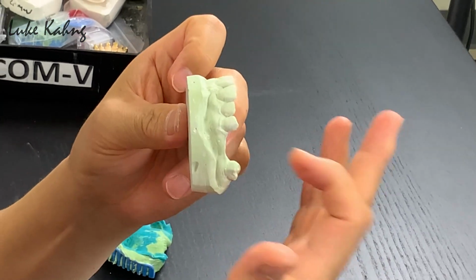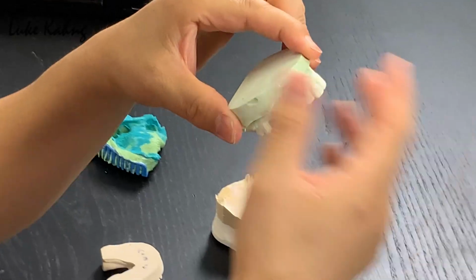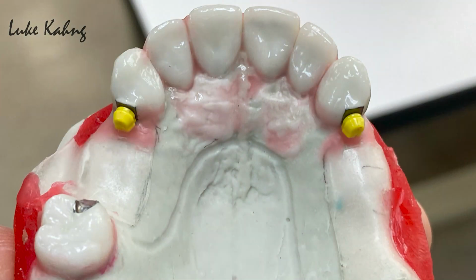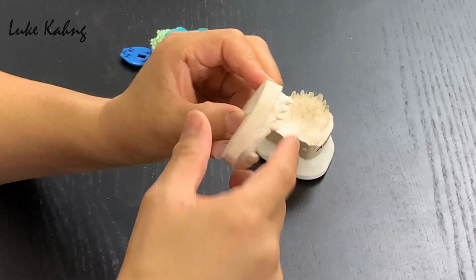So today, people don't want to make the bridge. People don't want to make the implant. People don't want to make a partial. Also, they want a crown that is aesthetically pleasing. So this is the case I would like to show. The doctor prepped individual 6 crowns, and here's 1 crown. Now we have to make them engage together until they decide on the future implant or future partial.